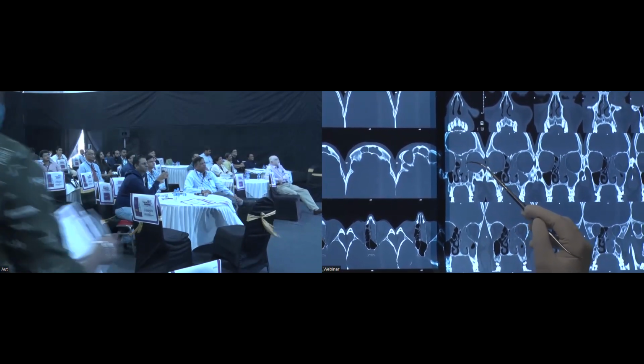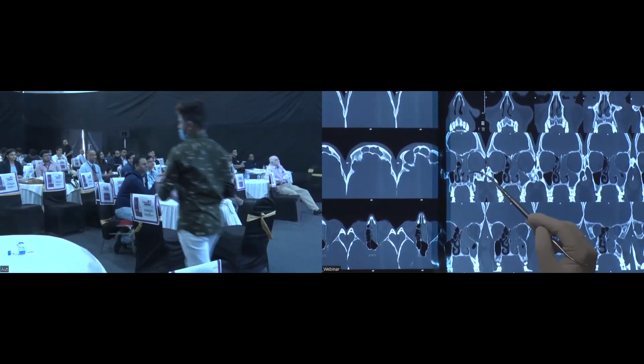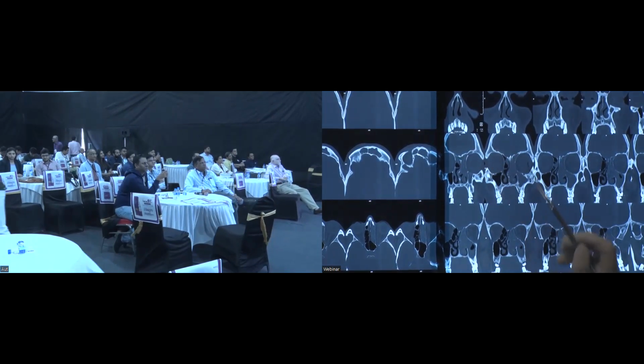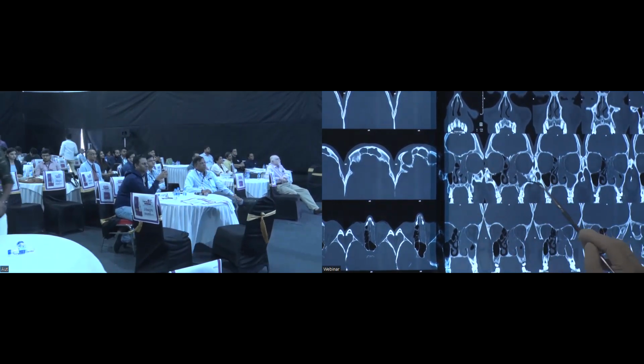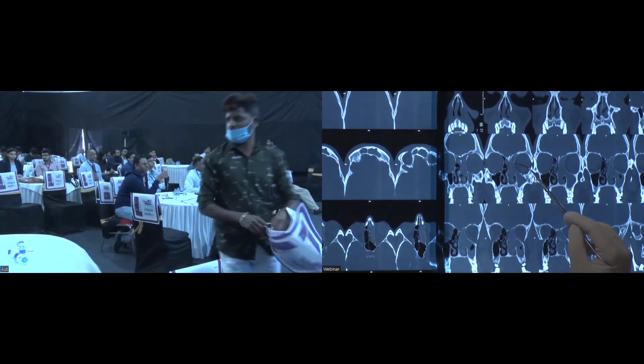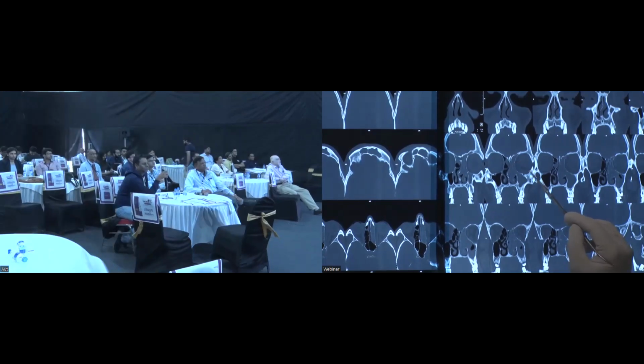The frontal nasal recess area is also widened because the septae within are very thin and flimsy. If you go down, you can see that the uncinate is attached to the lamina papyracea, so you will see something like a terminal recess.